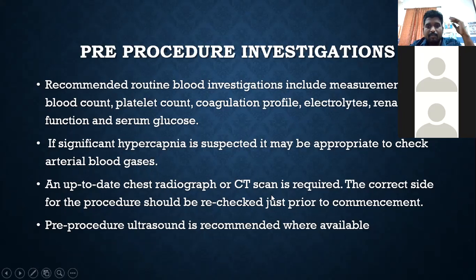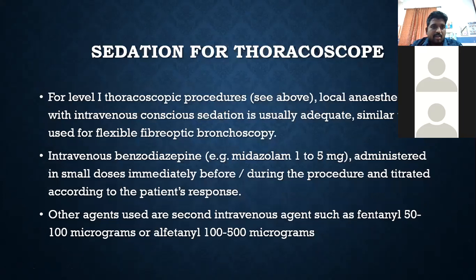Is a radiograph or CT scan required? As far as we are concerned, in any patient with a moderate to massive effusion, it's not good to do a CT thorax, because the CT will not show the underlying lung because of the massive effusion. It's always better to perform the CT thorax after the procedure. So we do an ultrasound. That's very, very important. Pre-procedure ultrasound is always recommended to know the level of effusion, to know whether adequate space is there or not, to know about adhesions, and what can be done. And to locate where to put the trocar, which is very, very important. So that's why ultrasound is very important.